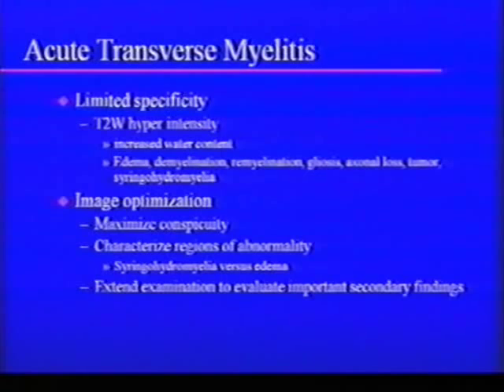But a very important point is although you can pick up where there's a pathologic process going on, and on neuroimaging that's often areas of hyperintensity, it's sensitive but it's not specific. So you might see that signal abnormality, but all that refers to in MR speak is that there's just an increased water content. But that increased water content could be due to a number of different things.